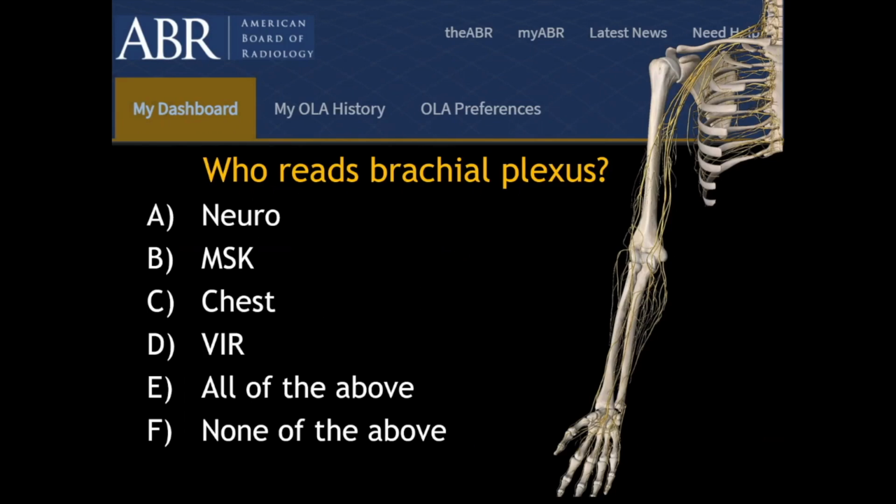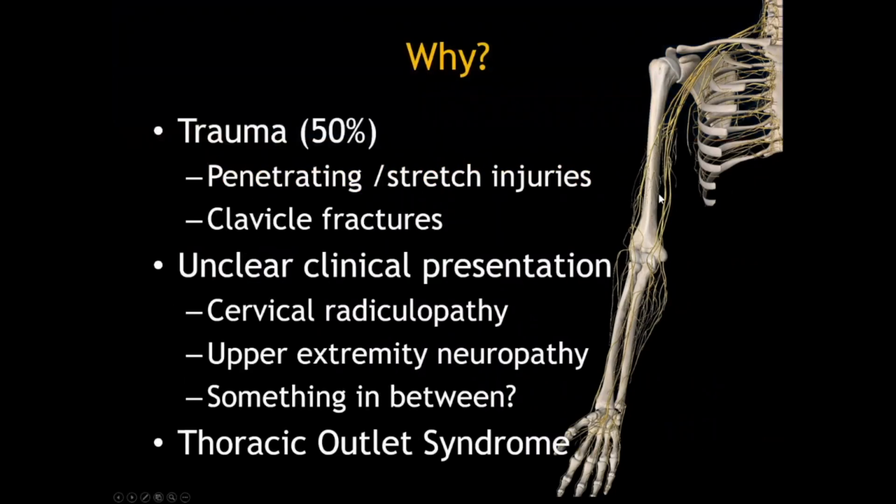You may encounter a brachial plexus study on your work list and may want to run away in the opposite direction, but hopefully in the next hour, you'll learn enough about the brachial plexus so that you'll be able to interpret these studies. Why image the brachial plexus?